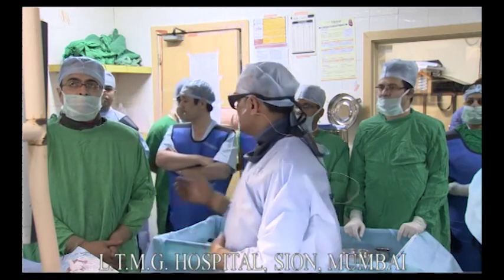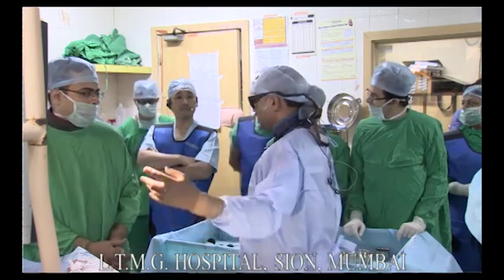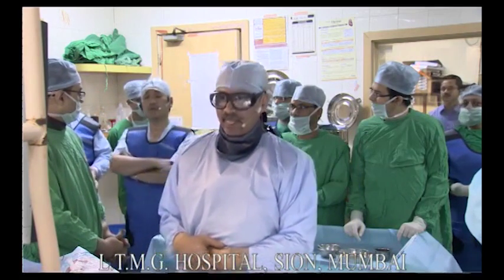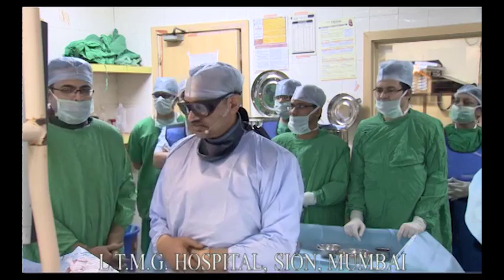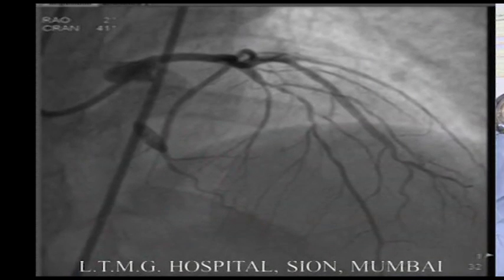So I'll just hand over the mic to Dr. Hamadaki, and he will talk about the approach to this case. Of course, as you can see, this lesion is long, and the proximal vessel diameter is big, and the distal vessel diameter is not so big.